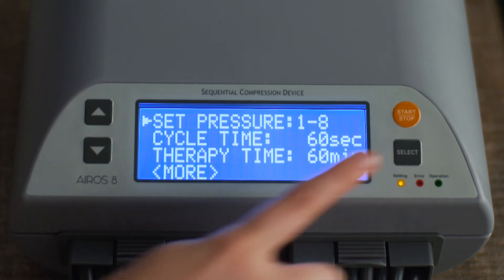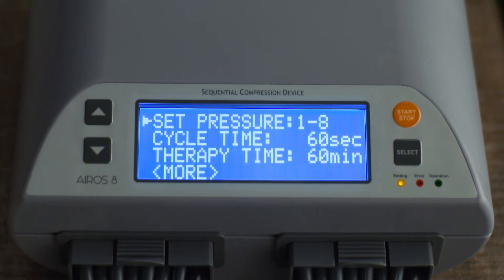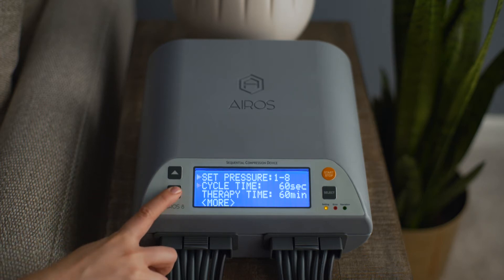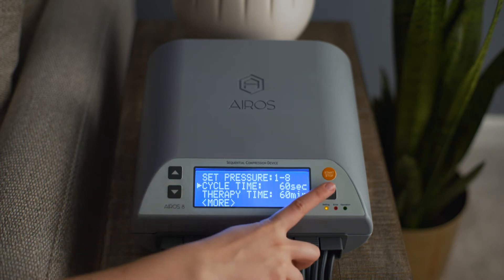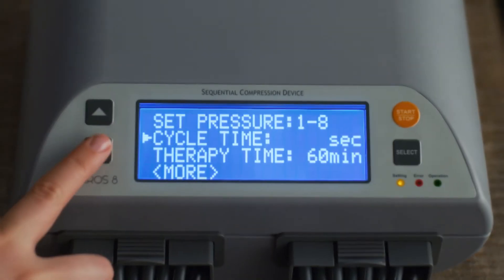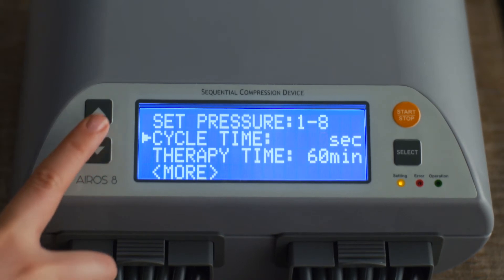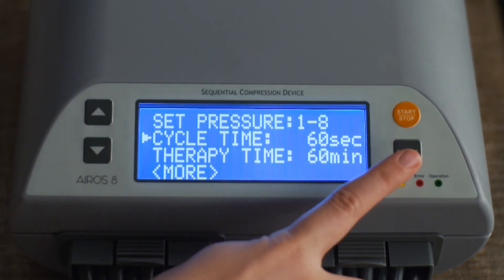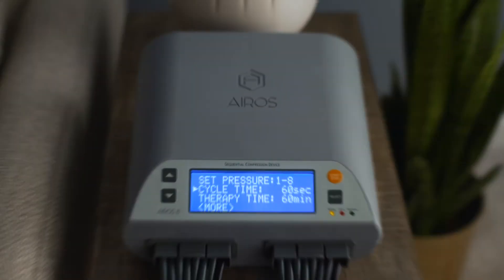Once finished setting the pressure, scroll down to Save Exit and press the Select button. To set the cycle time, scroll to Cycle Time and press the Select button. Cycle time can be set at 40 or 60 seconds. Press the Select button to confirm your selection.